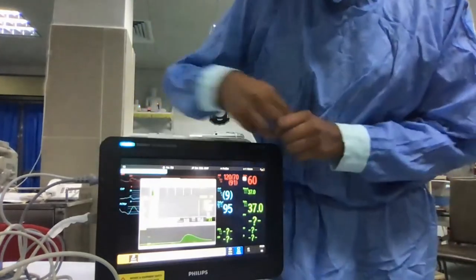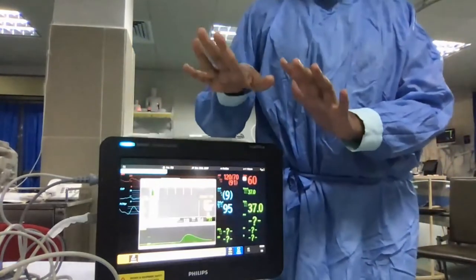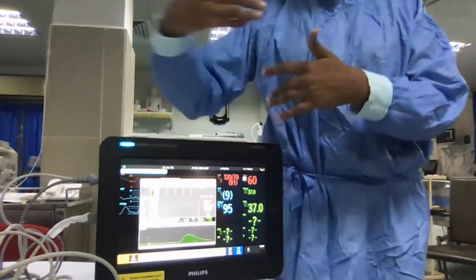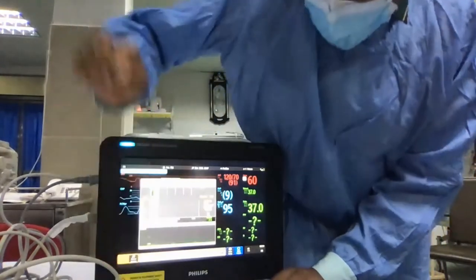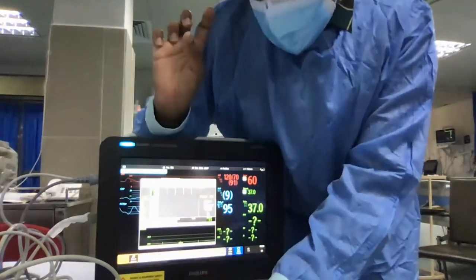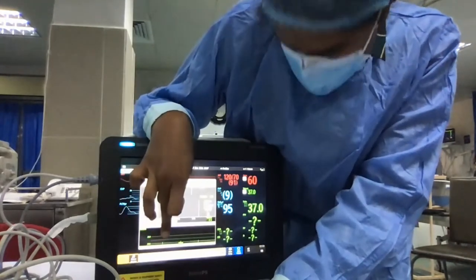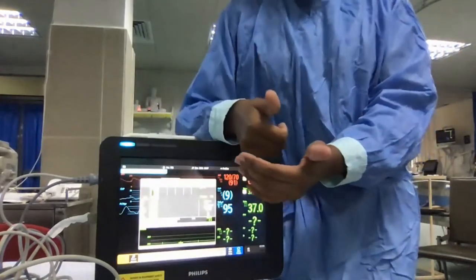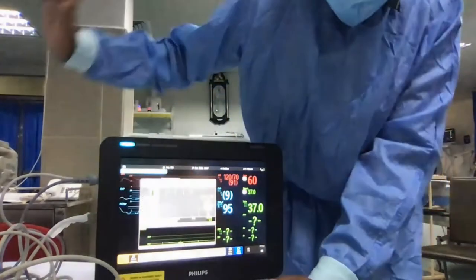I will do the second one. Like this, you have to take about three. If you are satisfied, you can stop with three, or else continue up to five measurements. I will do another one. Start cardiac output. Wait for the start cardiac output icon to appear in black. Then it says stable baseline, inject now. You can inject within 5 seconds without any jerks. I will do a demo injection again.